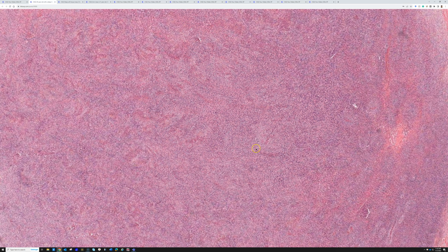If you have a good imagination, you could see that areas like this could get confused with myxoid liposarcoma. And if you haven't seen a case of myxoid liposarcoma, you can go on my Kiko directory, my mega index for soft tissue tumors, and I've got some examples on there, or you can see videos on my YouTube channel. But the myxoid areas of this tumor can look quite similar to myxoid liposarcoma, because they have bland oval to spindle cells arranged in a myxoid background with some little signet ring-like lipoblasts.